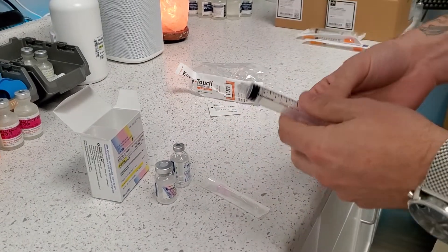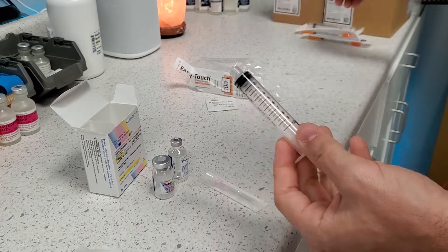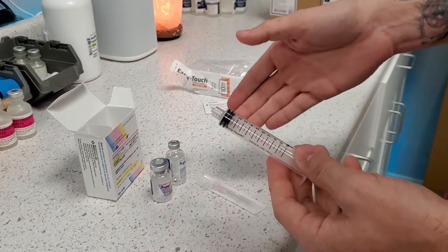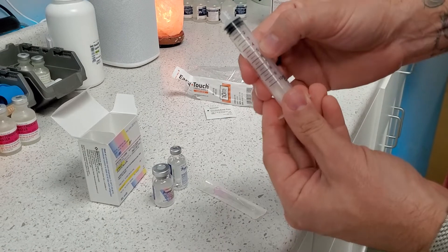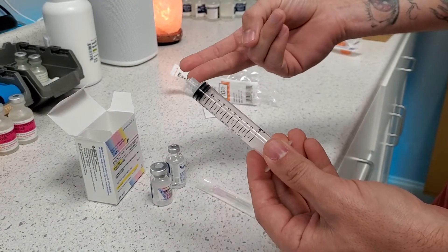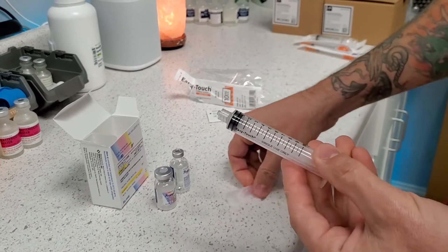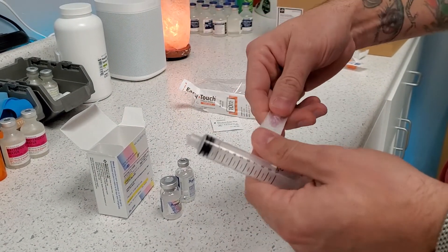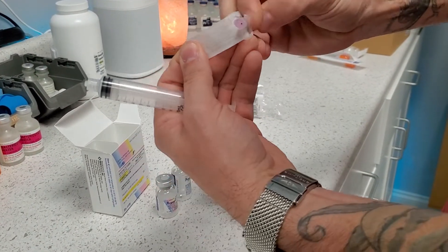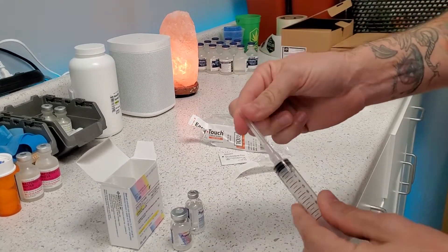Sometimes, depending on the supply, the pharmacy may give you a 20 or a 5 or a different size syringe. But no matter what, for our purpose, we're always going to do 10 milliliters. Even if the syringe is only 5 ml, we're just going to do the 5 ml of saline twice. One tip — never touch the sterile tips, so that we get a nice sterile connection. When you open these supplies, open them without touching the sterile tip. That way you can just lock them together and you have a nice sterile connection.